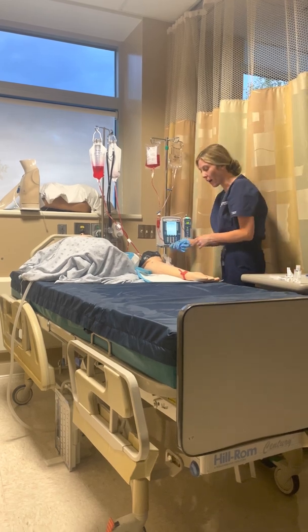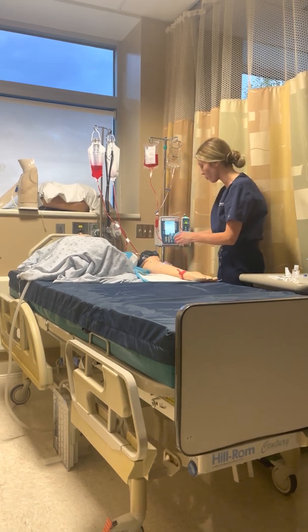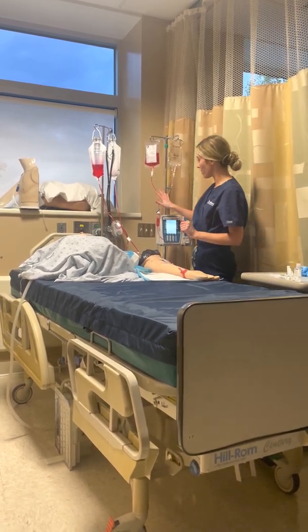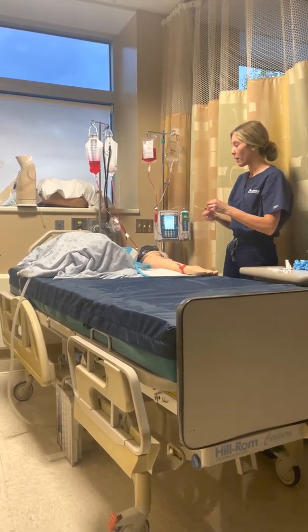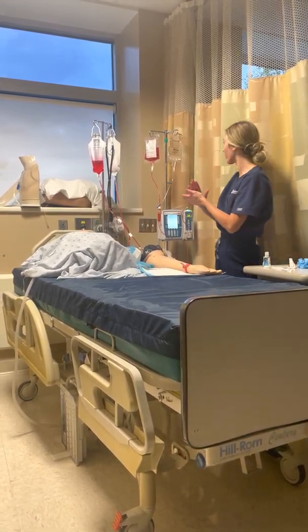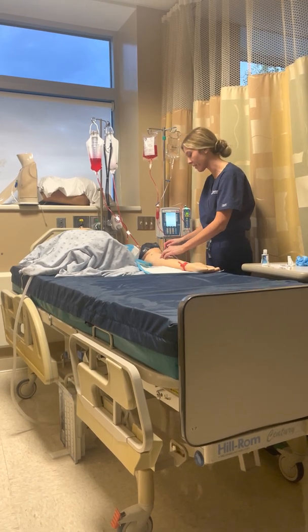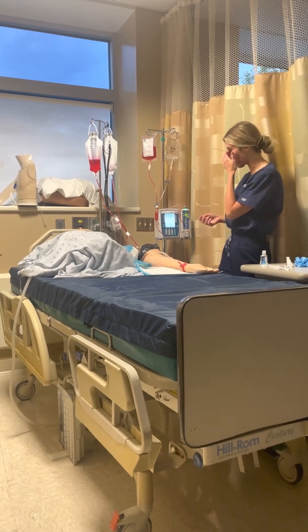All right, perfect. So I am going to stay with you for 15 minutes, okay, Betty? And just make sure that everything is going smoothly. And then I will also be assessing vital signs every 15 to 30 minutes. Once the blood fully transfuses, then we'll want the normal saline to transfuse, okay? So then I would document here the date and time, how much blood we gave, the type of blood that we gave, and also the IV assessment as well, okay? So like I said, I'm going to stay with you for 15 minutes and we'll reassess those vital signs every 15 to 30 minutes.